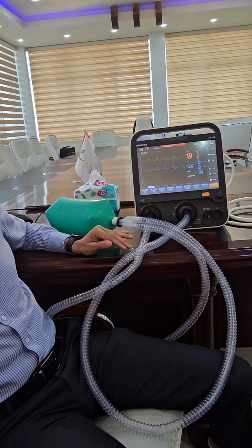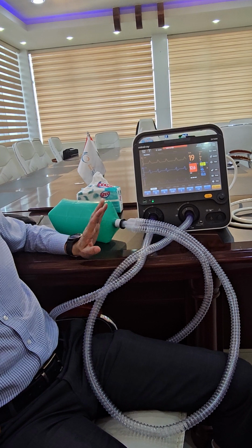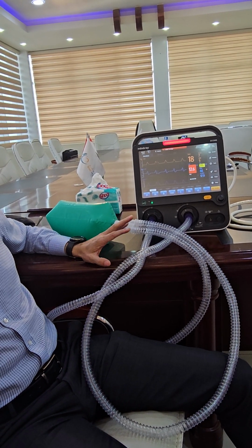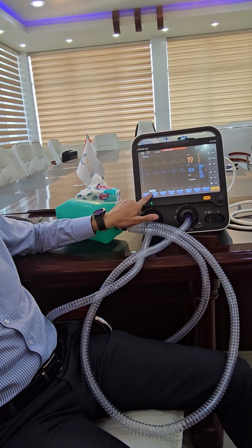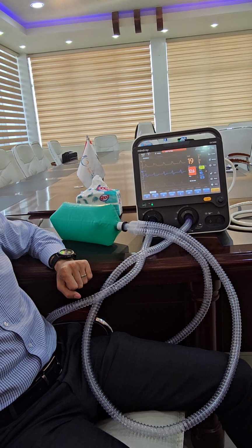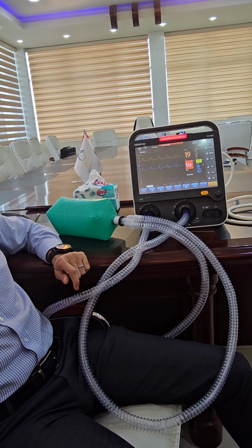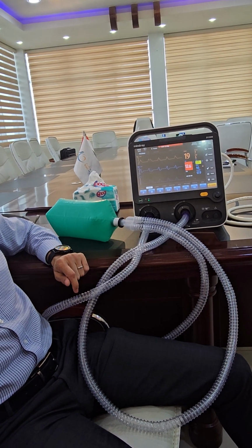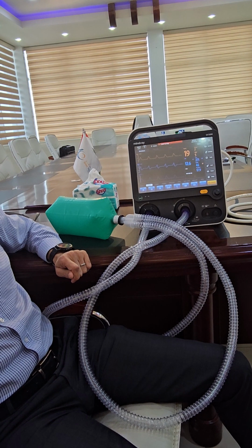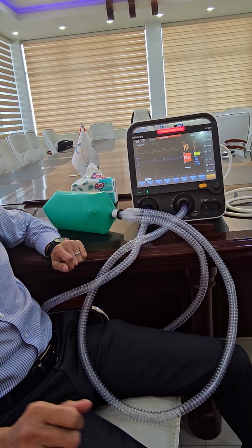Pressure control is used for long-lasting ventilation in the PICU. So now the modes of ventilation. The most important mode is the AC, assisted control. Some people call it SIPPV, synchronized intermittent positive pressure ventilation. Assisted control or SIPPV.